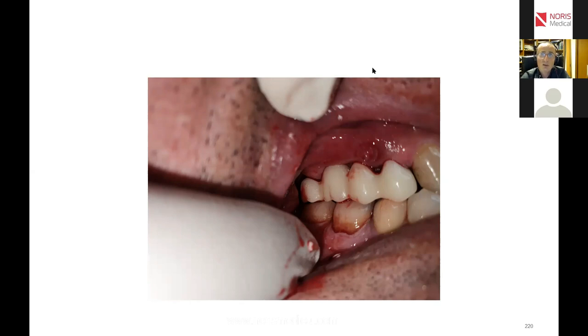The reason that I use a small amount is that it will not go under the undercut. When you are taking into consideration every case that is cemented, you cannot really assure that all the implants get the same force. So I think that actually I use a temporary cement, relatively strong one, but with a small amount.